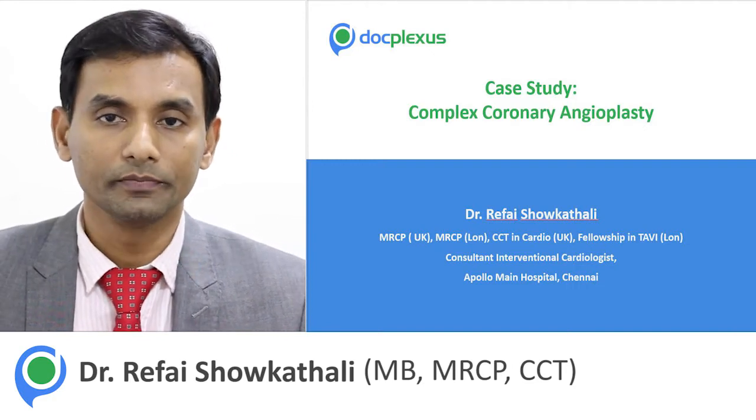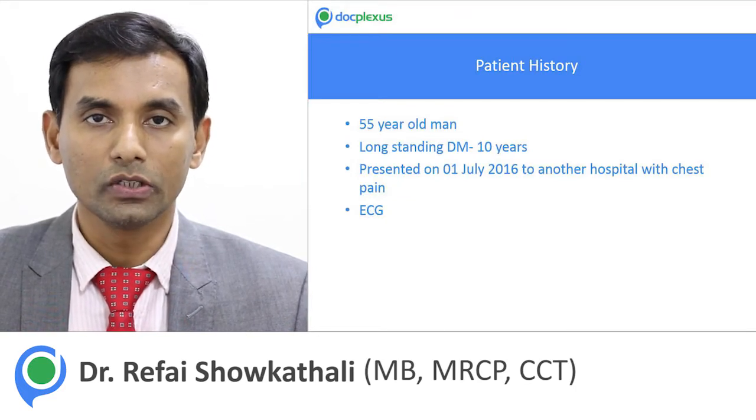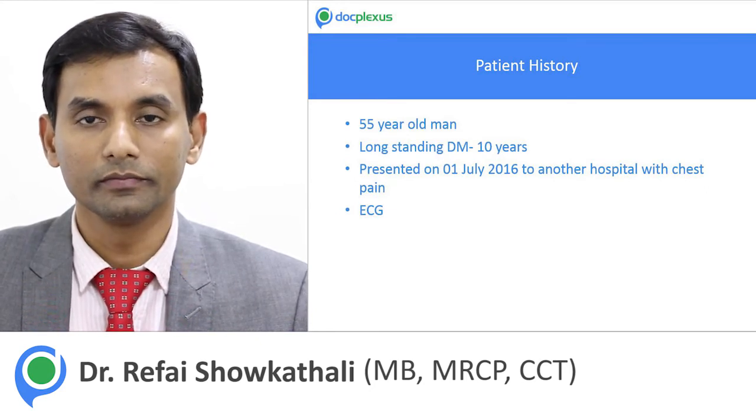before moving to India. So here I am going to present an interesting case of a patient who underwent a complex coronary angioplasty, and the topic is going to be about mending the heart by drilling.